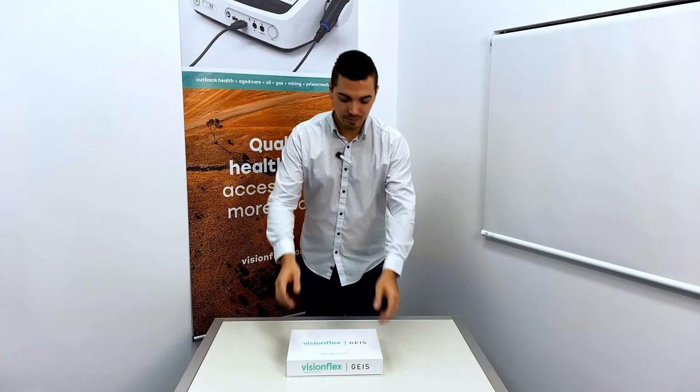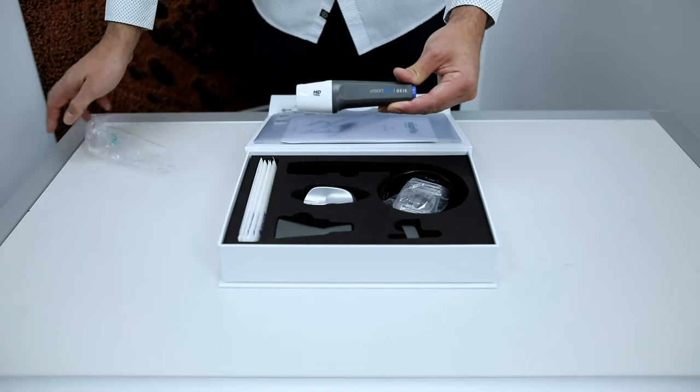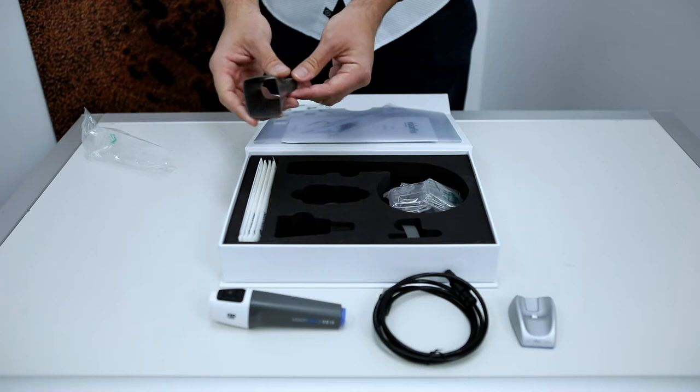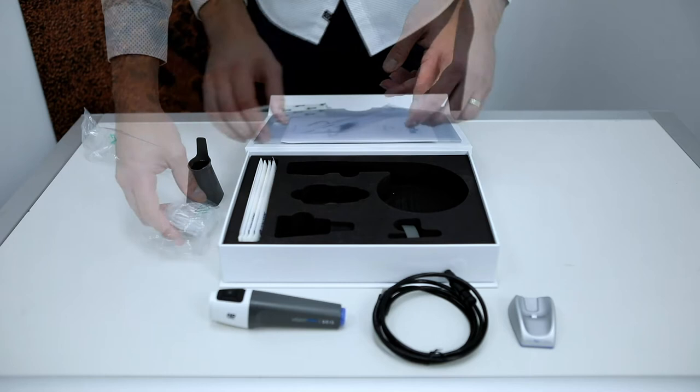When you open your box you'll find a GEIS camera with a USB cable, a GEIS cradle to hold the camera when it's not in use, a dermatology hood, and ten dermatology hood disposable caps.